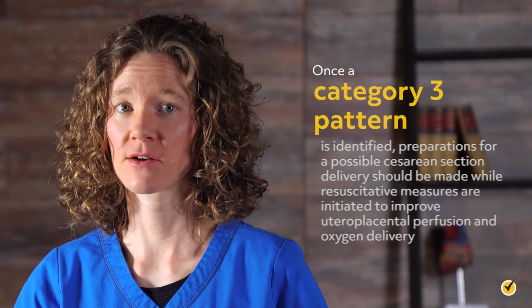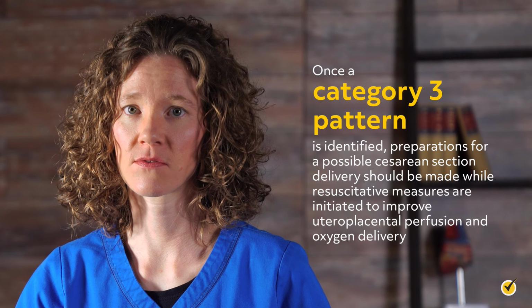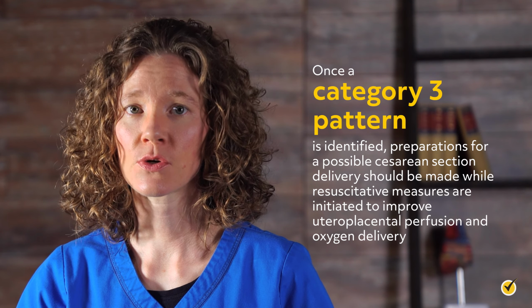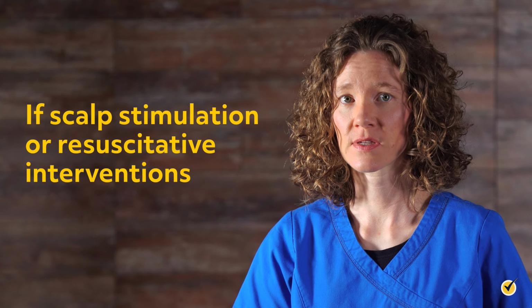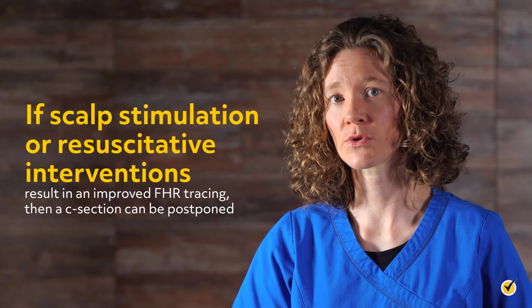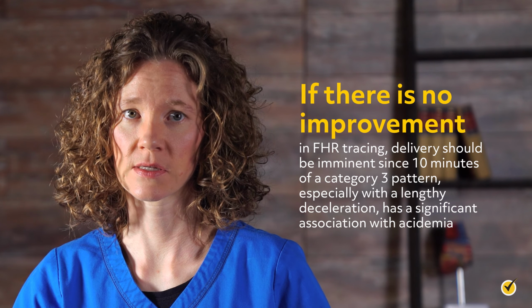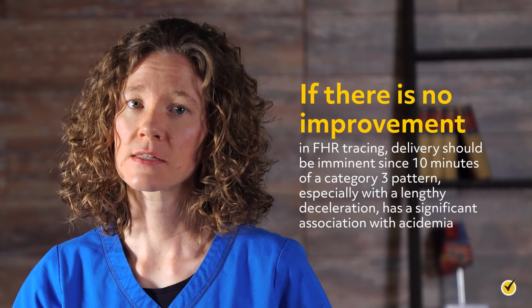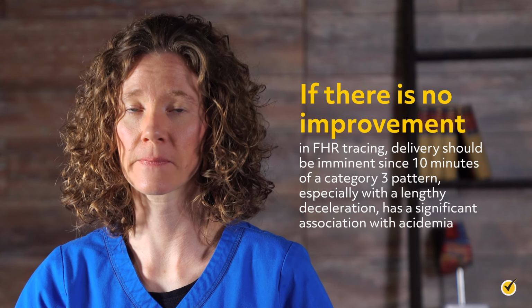Once a Category 3 pattern is identified, preparations for a possible cesarean section delivery should be made while resuscitative measures are initiated to improve uteroplacental perfusion and oxygen delivery. If scalp stimulation or resuscitative interventions result in an improved fetal heart rate tracing, then a C-section can be postponed. However, if there is no improvement in fetal heart rate tracing, delivery should be imminent since 10 minutes of a Category 3 pattern, especially with a lengthy deceleration, has a significant association with acidemia.